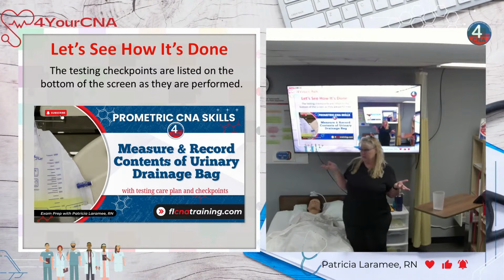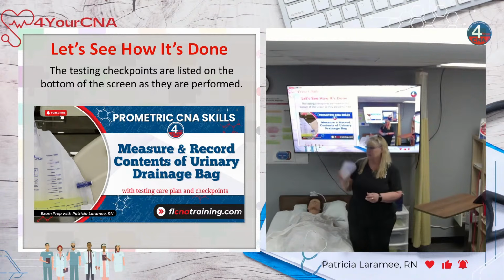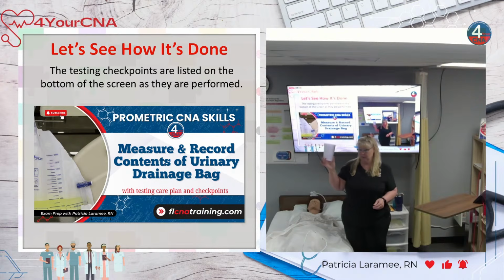Most of the other skills you can kind of get away with making do at home, right? You can use a Tupperware container for a wash basin and do hand and nail care on somebody at home. You can use a belt as a gait belt. You can make do with things you have around the house. This is one skill where you really don't have that opportunity because you don't have one of these at home. You don't have a catheter or a bag at home. You can't really get used to that T-valve, how it works.